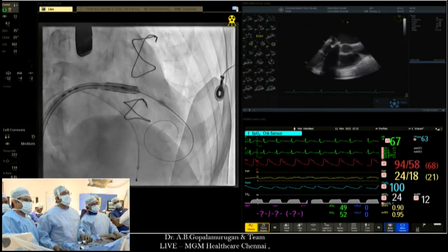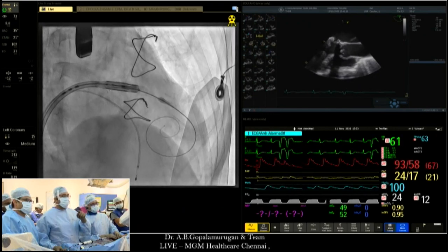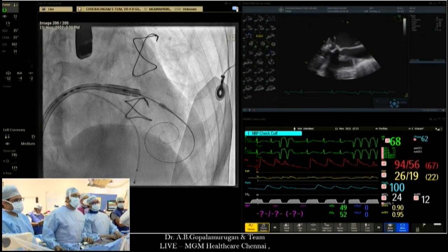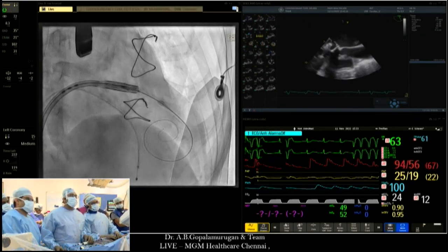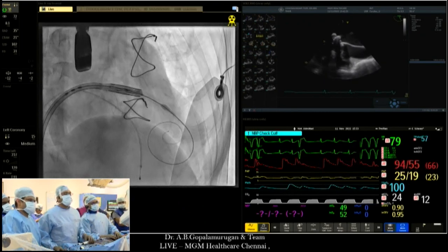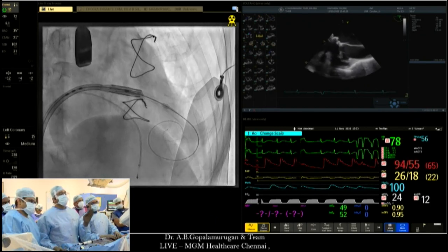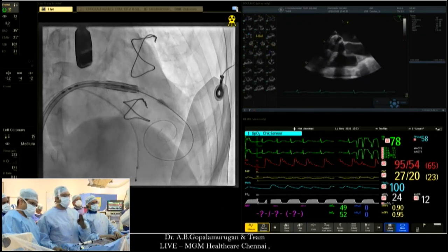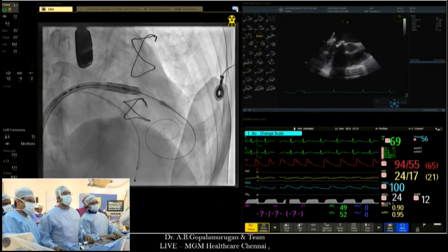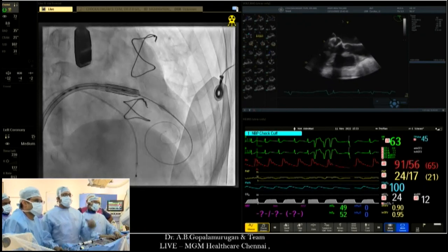That's the only way. And mind you, the valve is going to open from atrial to ventricular, which means we have reversed the valve direction that you would normally do for a TAVR. So I'm going to keep it about 20% atrial and 80% ventricular. The downside of an Epic is you can't see the pillars, because if we saw the pillars, you could position the ventricular end at the pillars and accept whatever you get atrially. But you can't see the pillars, so you have only one option, which is to go by the valve ring, which you can see there.